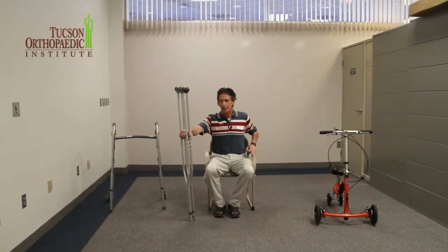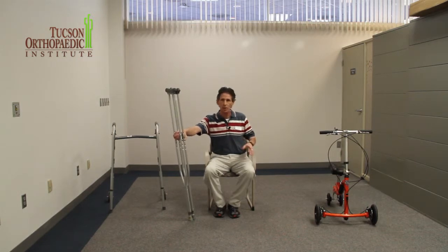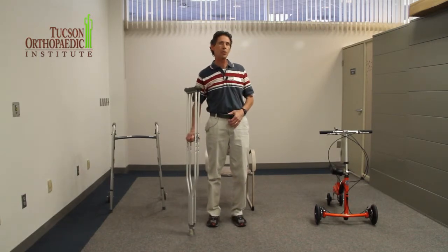So this is how you use crutches when the doctor does not want you to put any weight on one of your legs. And if you would like more information about other assistive devices, you can go to tucsonortho.com.